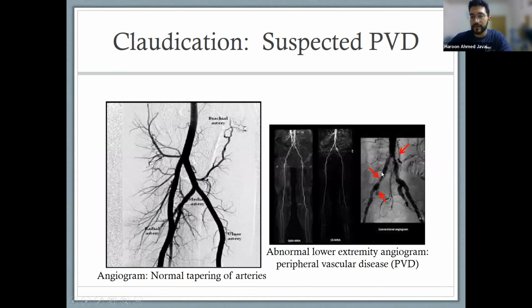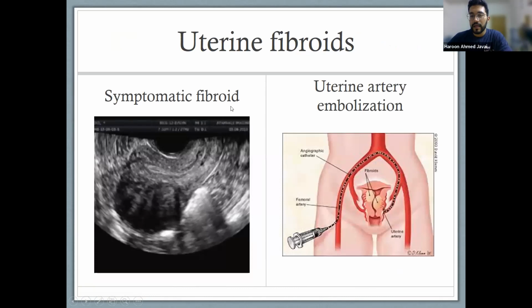this area. So this is the iliacs. They'll reach this area, and once they reach this area, they will place a stent over here. The stent is basically like this metal spring which will open up the vessel and it will allow blood flow to keep on going. Okay, so that's where the intervention part comes in.